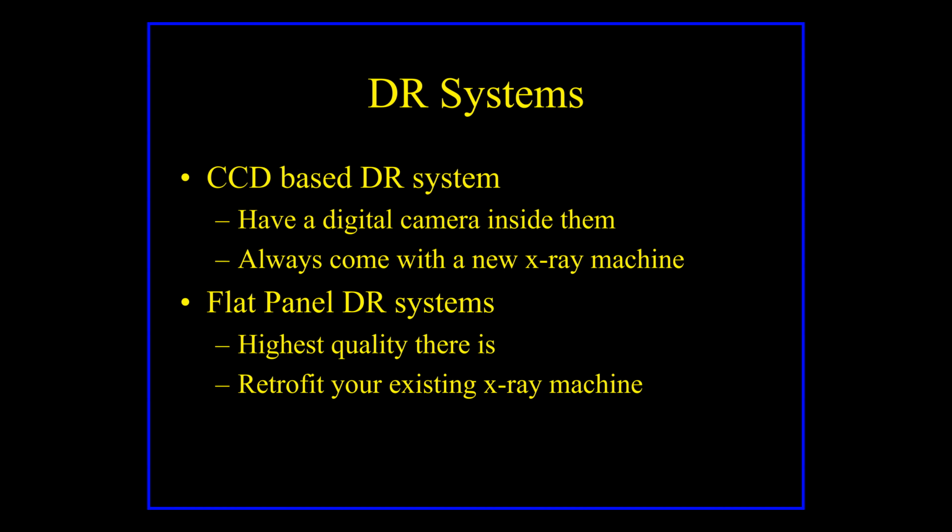Okay, and so you have to be really careful of that, because some of the stuff that they tend to sell is crap. So the best way to shop for an x-ray system probably is get advice from a radiologist like me or Dr. Ward or anybody else that may be in your area, and say, hey, do you read images from this Fuji x-ray system, and if so, are they good? Okay, that's probably the best way to shop for them.